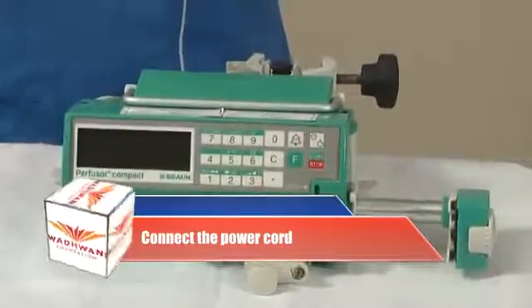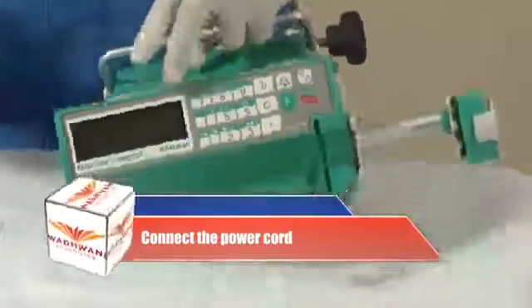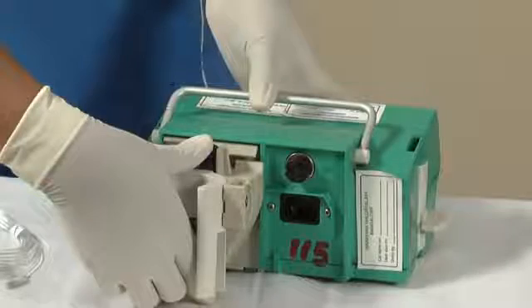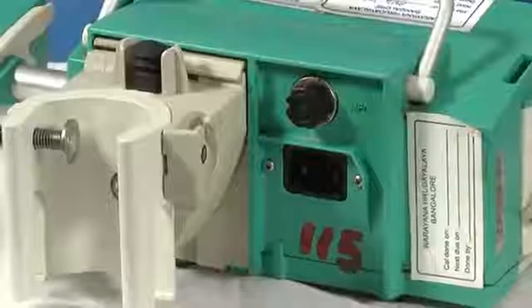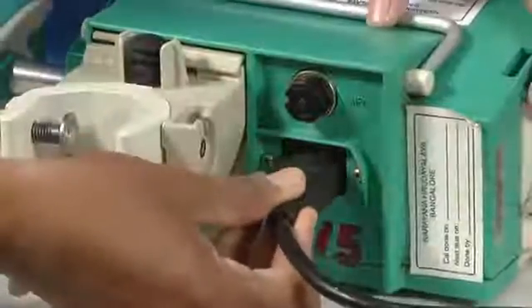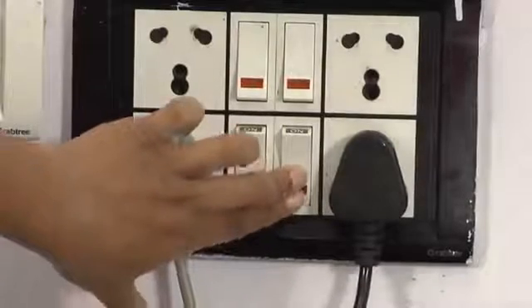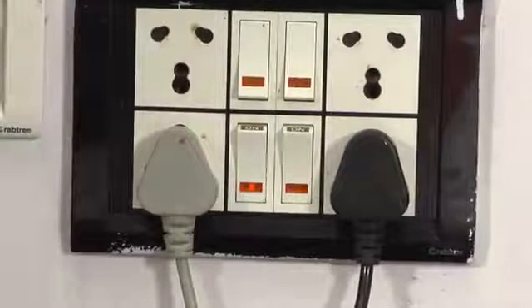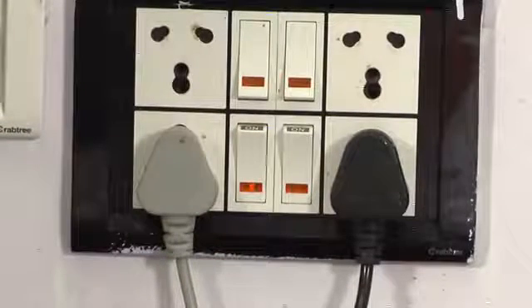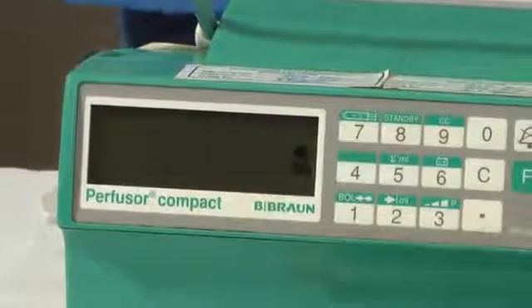Connect the power cord. The syringe pump should be placed on a clean, level surface. Before turning the pump on, we need to connect it to electrical sockets using the power cord. First connect the power cord end to the mains socket at the rear of the syringe pump. Then take the plug and connect it to the electrical mains. Turn on the mains switch. As you can see, the display indicates that power is connected to the pump.